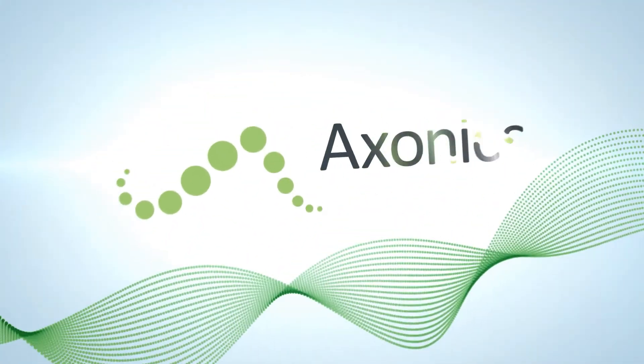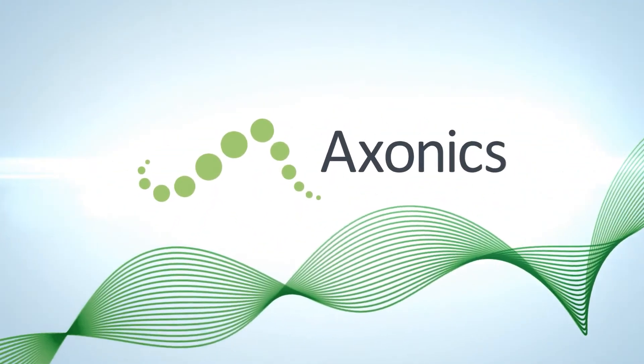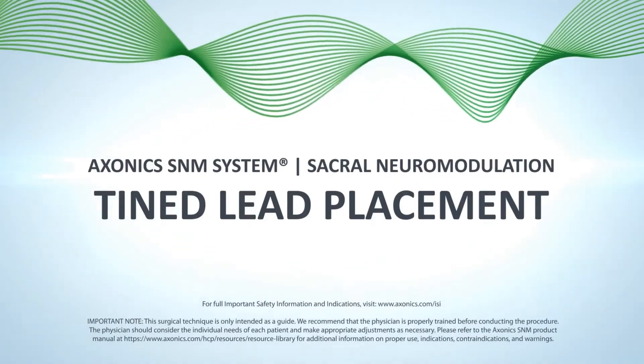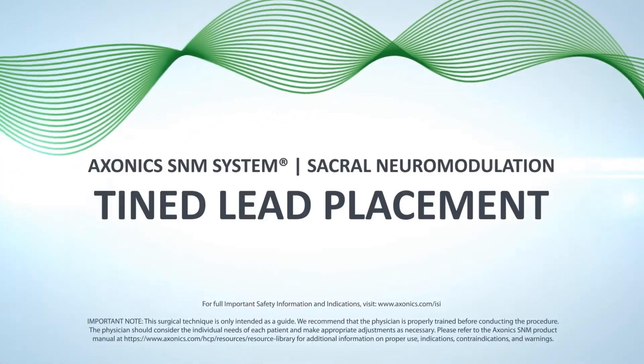This animation demonstrates the tined lead placement in preparation for either an advanced trial or a full implant of the axonic system.